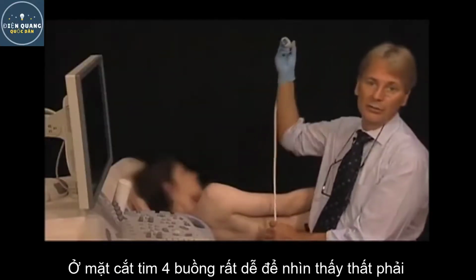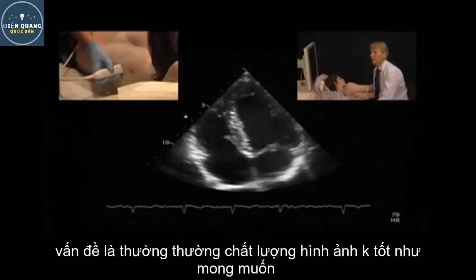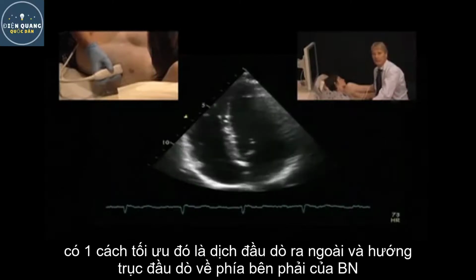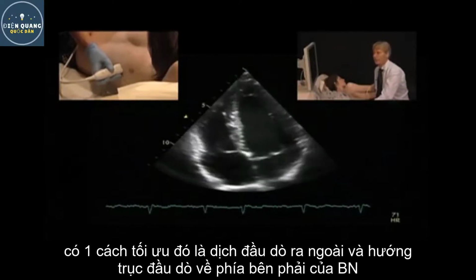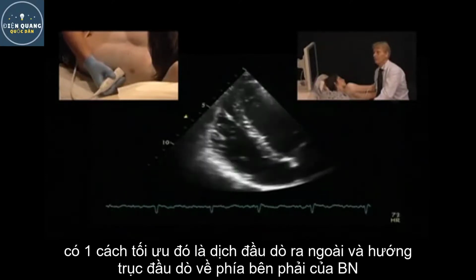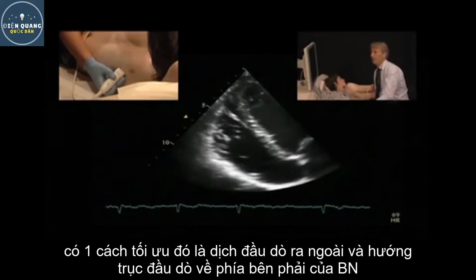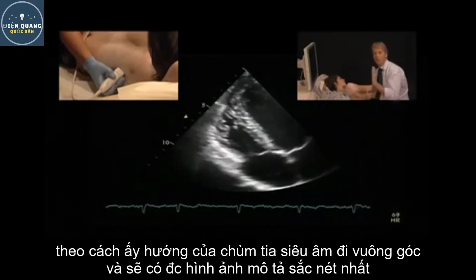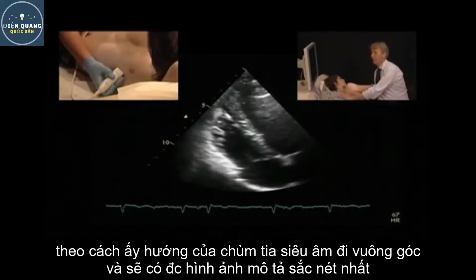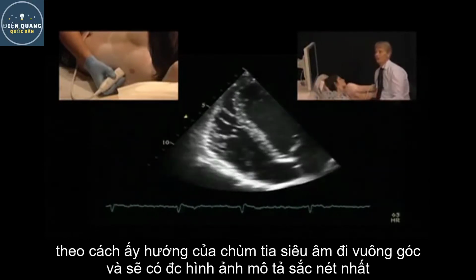In the four-chamber view, it's easy to see the right ventricle. However, very often the quality of the images is not as good as you would like them to be, especially for the right ventricle. There are ways of optimizing this view, and this is by simply moving the transducer more laterally and pointing the transducer more towards the right side of the body, and thereby you have a more perpendicular orientation of the ultrasound beams to the lateral wall, and you have a much better delineation of the endocardium.